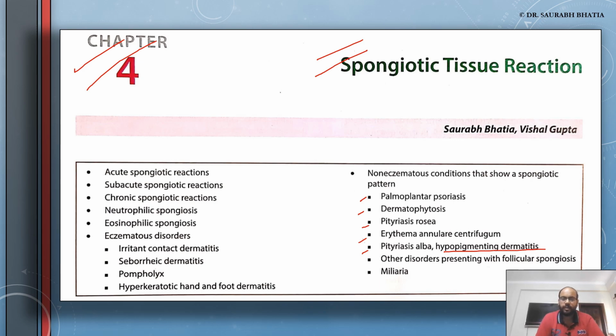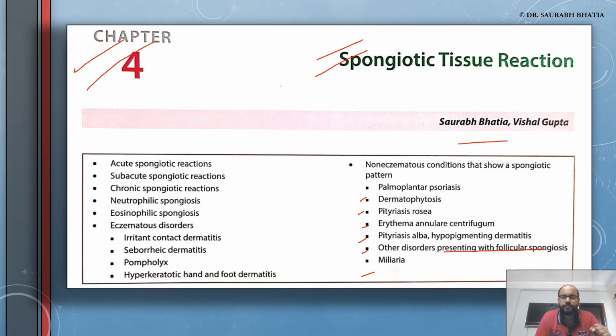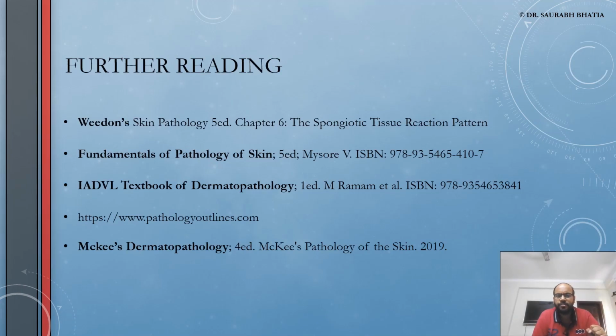And you can in fact appreciate, I don't want to draw, otherwise it will cloud it. Look at this area. Just a second. Look at this area. These are the hyphae of the fungus. So dermatophytic hyphae. So whenever you see spongiosis and neutrophils in the upper layer of the epidermis, search for hyphae, search for spores. Okay, let's move forward.